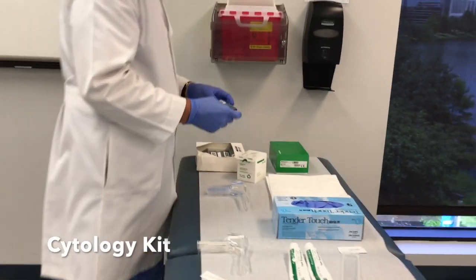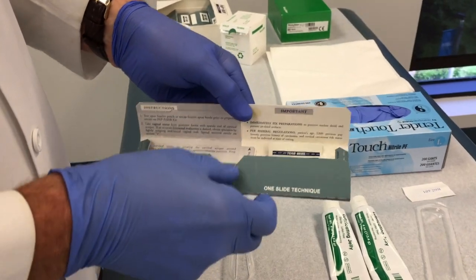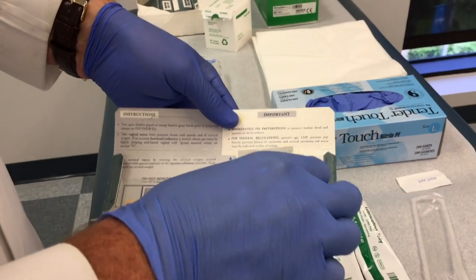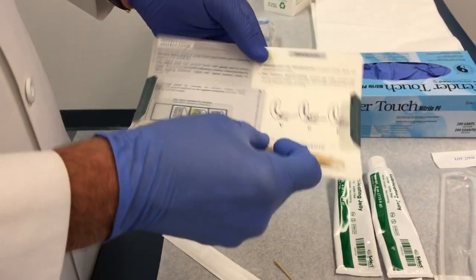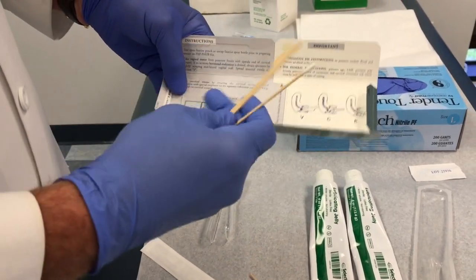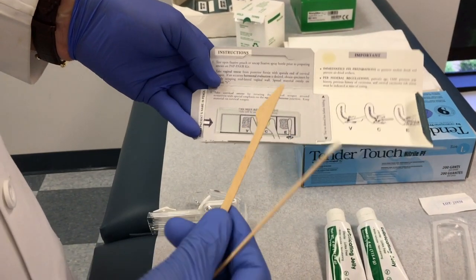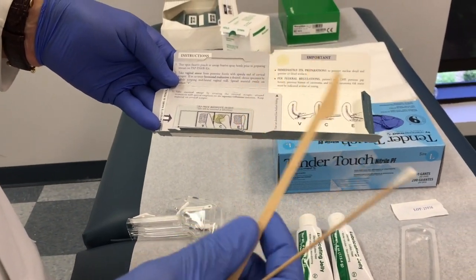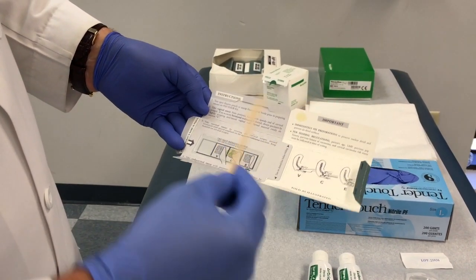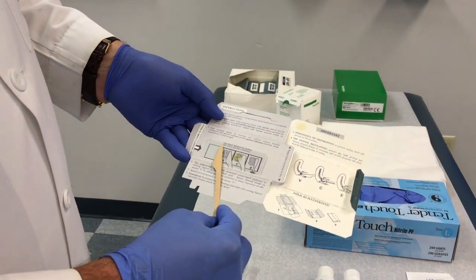Real quick about the cytology kit — this is kind of an older type of cytology, but offices still use this. This is where you actually have to fix your specimen to a slide. There's a glass slide in the case as well, with instructions on how to submit the cytology. With the spatula side, we're going to take a sample from the posterior fornix — it's a simple slide motion.